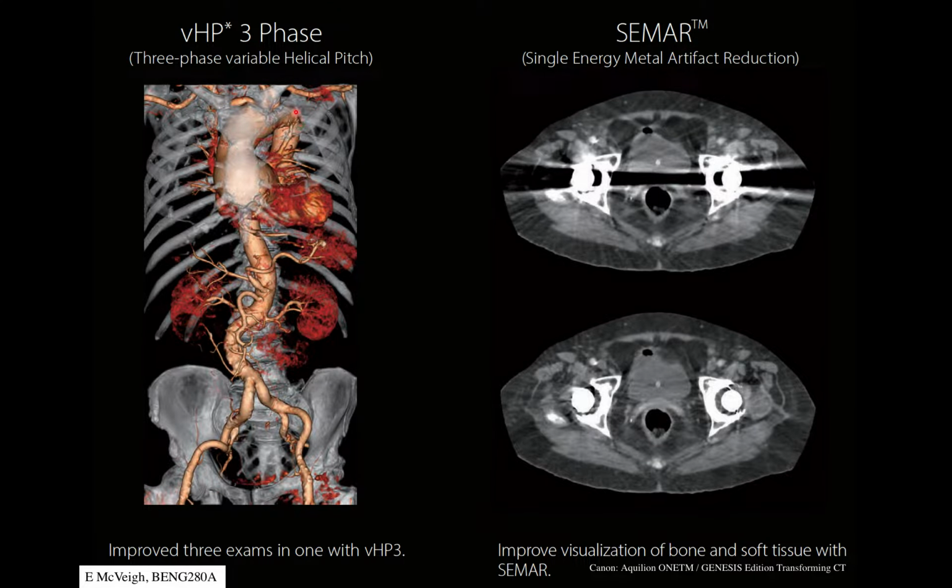You can get images of the entire body very rapidly now, like from head to toe, essentially, on a CT scanner. You just push the patient through the scanner and continuously acquire data, right? In this case, we're going from this patient's collarbone all the way down to the bottom of their pelvis in order to measure the function or the shape of their aorta.